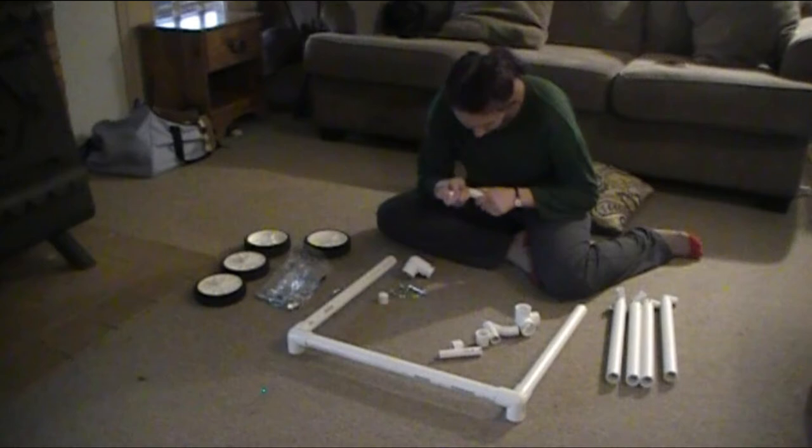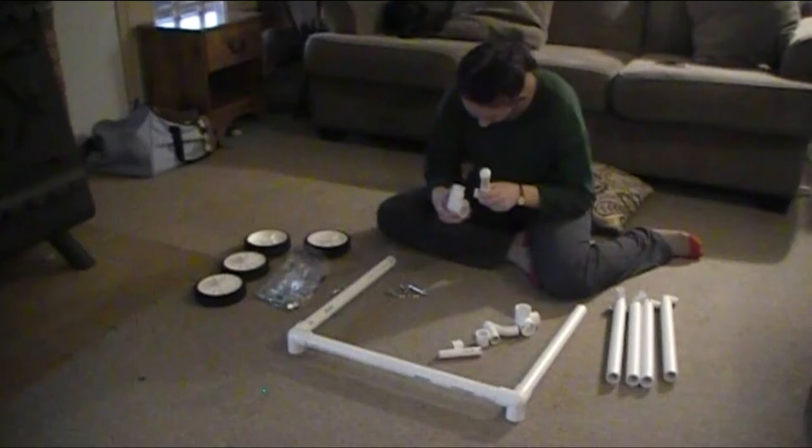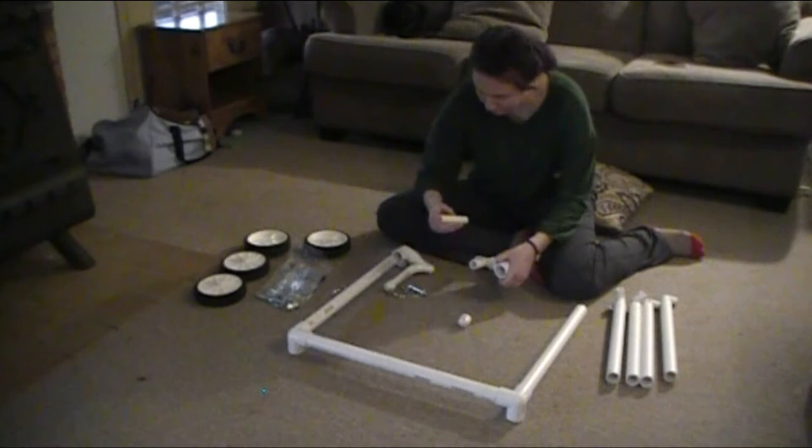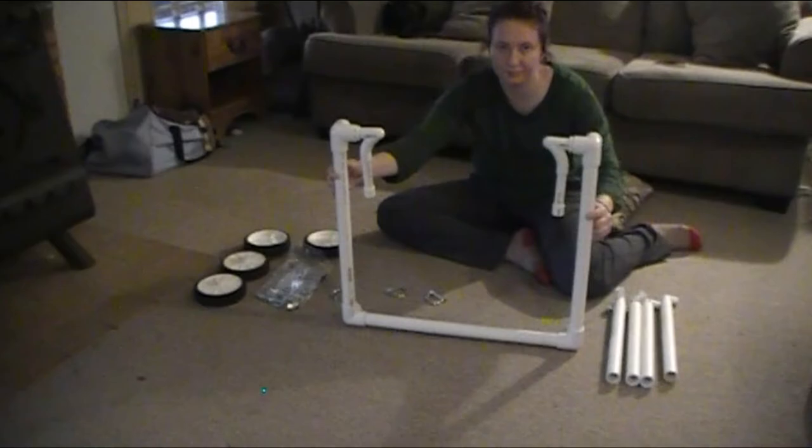Always do a dry run and mark the angles of attachments with a permanent marker before gluing, because the cement glue dries super fast — it only allows about 10 seconds for adjustments. During the dry run, a wrench was also needed to get parts apart, which is why it's included on the materials list.